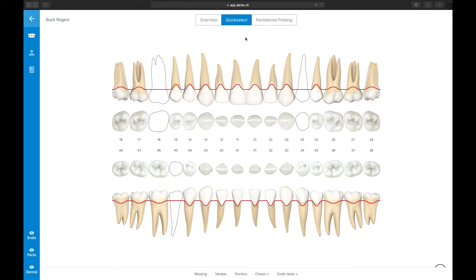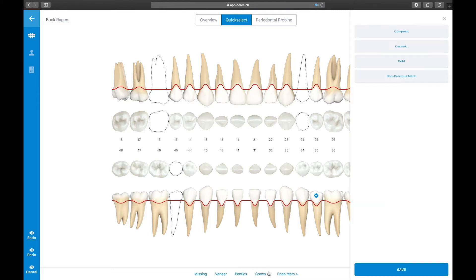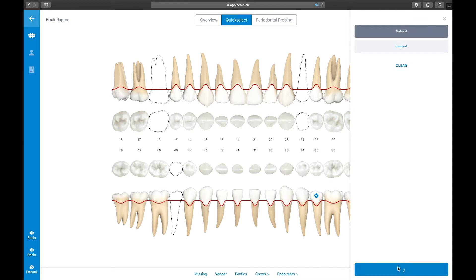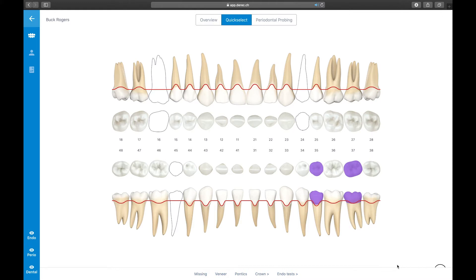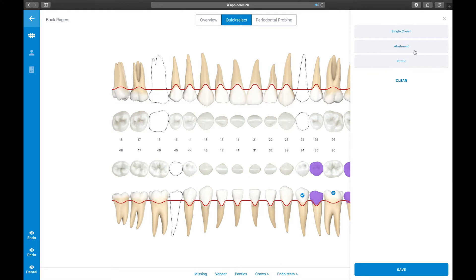Let's use the Quick Select function to enter a tooth-carried cantilever bridge going from tooth 37 to 34. First, make sure the Quick Select function is activated. Then select the abutment teeth on the chart. Select Crown from the menu at the bottom of the screen, choose the material of the bridge, define the selected teeth as abutment, select Natural since the bridge is a tooth-carried bridge, and hit Save. Next, define the pontics of the bridge by selecting the teeth which replace the missing teeth, selecting Crown, choosing the material, defining the selected teeth as pontics, and hitting Save.